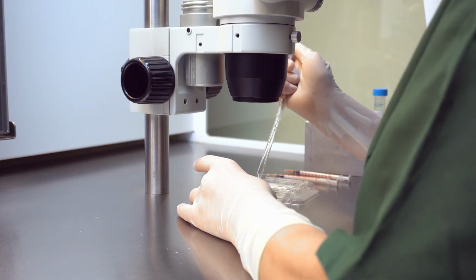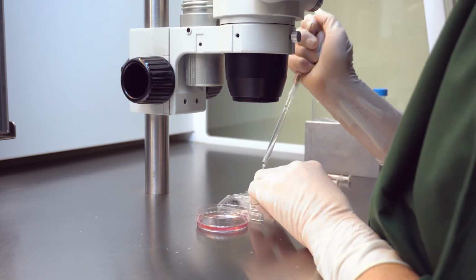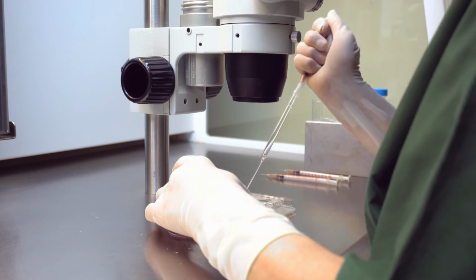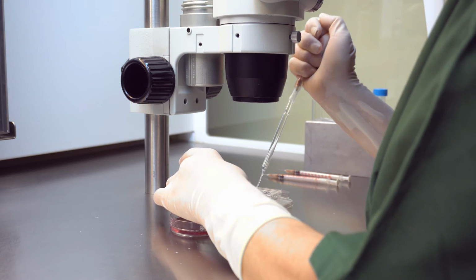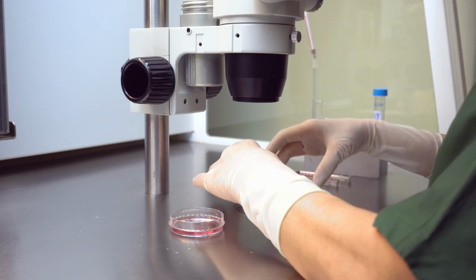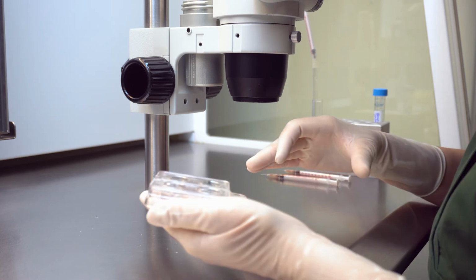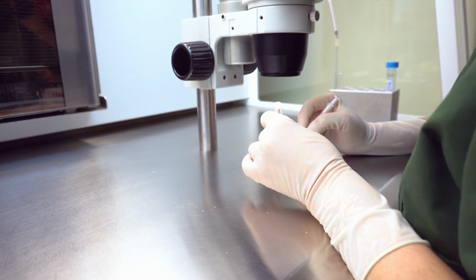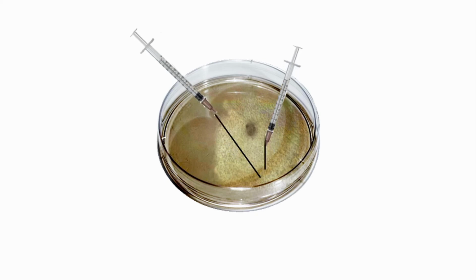It is noteworthy that the cumulus oocyte complexes do not undergo denudation process prior to conventional IVF. Hence, they are inseminated with the sperm suspension directly, without subjecting them to hyaluronidase. After egg retrieval, cumulus cells are partially dissected by a needle tip and washed in buffered solution.